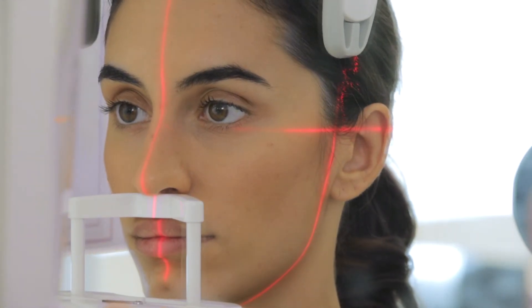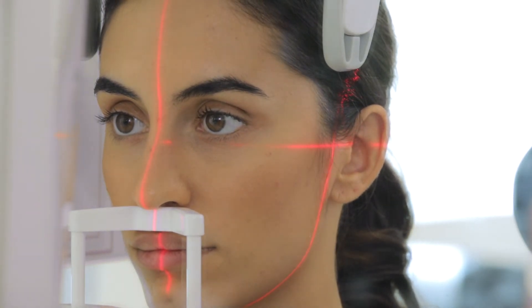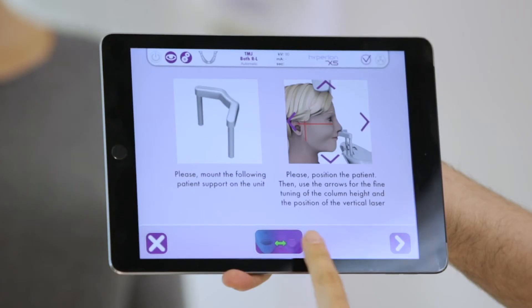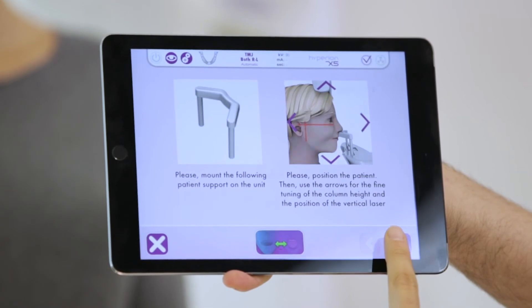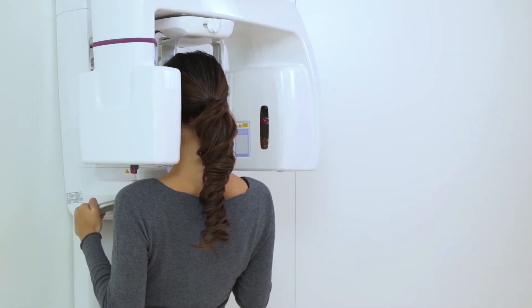Make sure that the vertical focusing laser is in line with the condyle head. Otherwise, adjust via the special keys. Now, NEXT is pressed and before leaving the room, the dentist asks the patient to close her eyes and not to move.